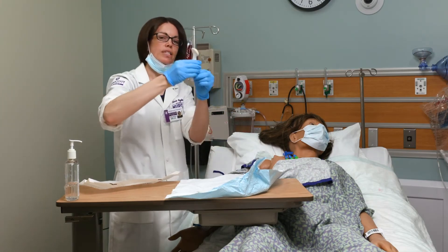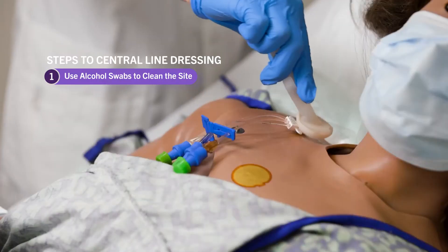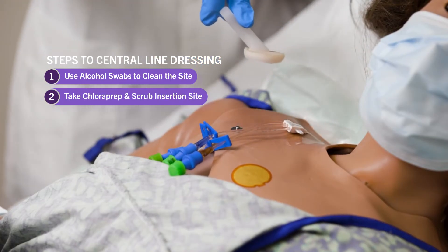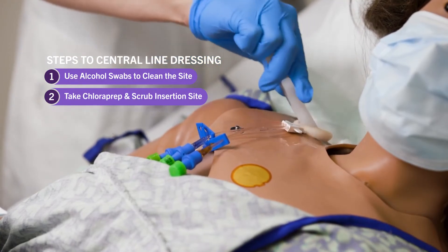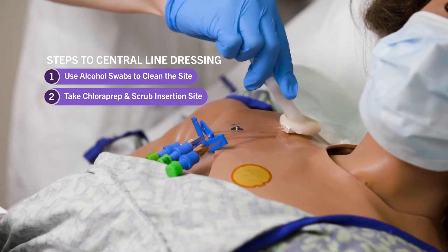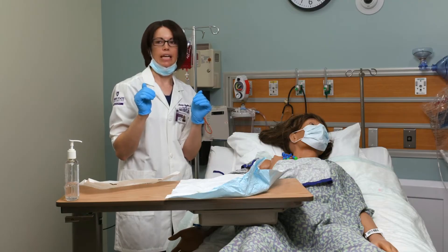Next I'm going to take my chloroprep and activate it by squeezing the two wings. After that I want to make sure I'm scrubbing back and forth, up and down, covering the insertion site and going three inches from the center all the way around, and three inches down the lumens. I need to scrub for at least 30 seconds. Once I've completed the 30-second scrub, I'm going to allow that to air dry — I don't want to blow on it or wave on it, so I'm maintaining sterility of that site.